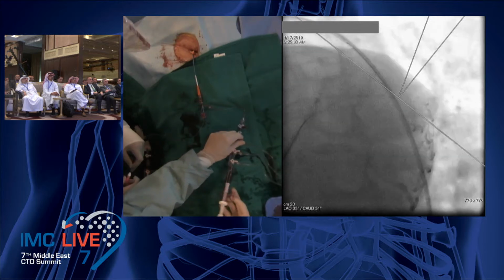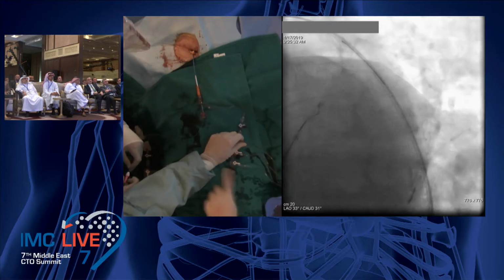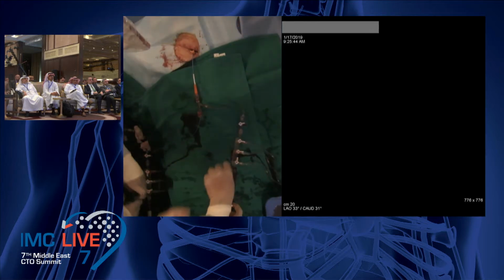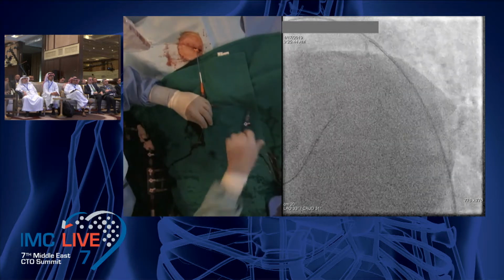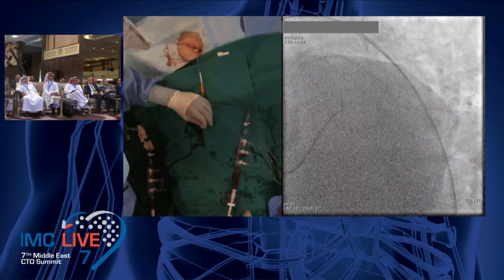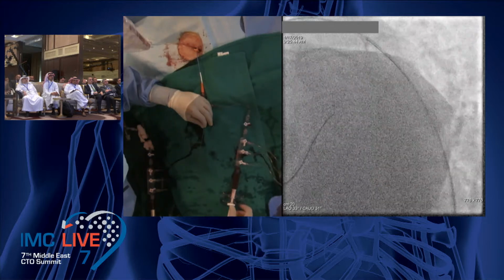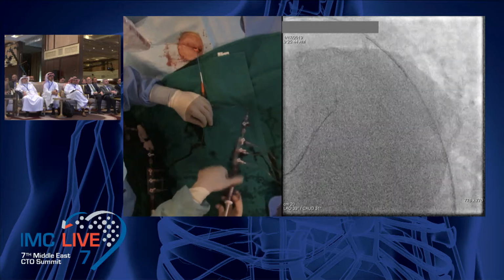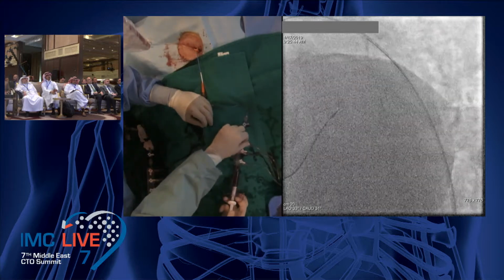In case of tortuosity with some calcification, this wire is very useful, and in my opinion, it is better than the normal XT. Actually, for antegrade, I always use XTR for starting the wire. The tip control is excellent.